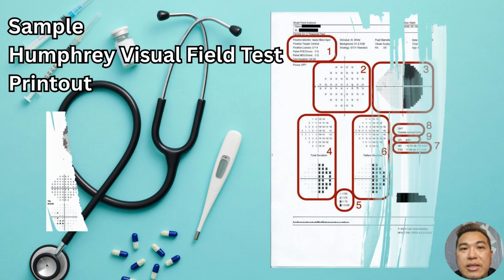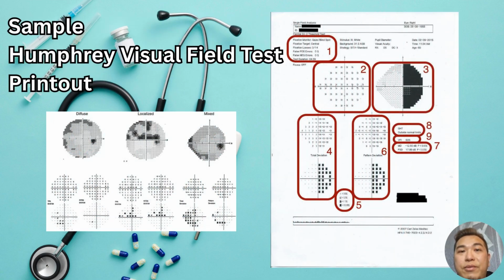This is an example of a printed result from the Humphrey Visual Field Analyzer. At the top right, it shows patient information such as the name, date of birth, and test date. The numbered sections display different parts of the result. Patient and test details for identification and reference. Numerical threshold values showing the patient's sensitivity at each test point. Grayscale plot, a visual map of the field, where darkest areas indicate reduced sensitivity.